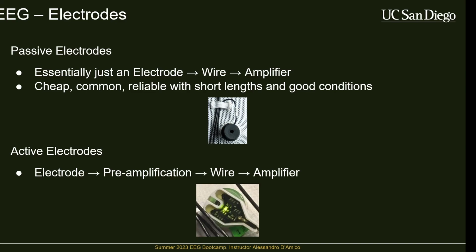If you've ever experienced this, I have a really cheap guitar cable that I bought like 10 years ago. Now, whenever I plug it into my preamplifier, even when it's plugged into my bass, the wire is so long and unshielded that I can hear AM radio on it. It's just passively picking up this radiation, and you can actually listen to the radio on this cheap wire. To some extent, although these wires are much thinner and a lot shorter than that, the longer they are, the more they act like antennas for noise. So you want to have shorter wires where possible.